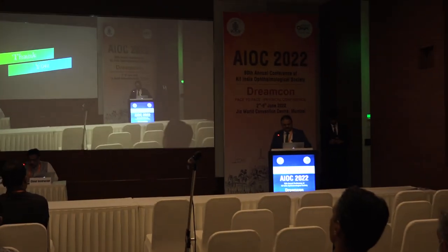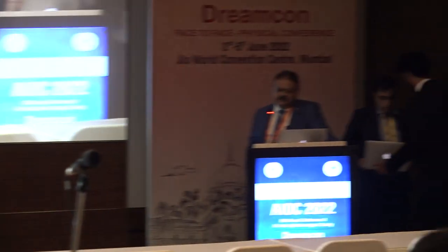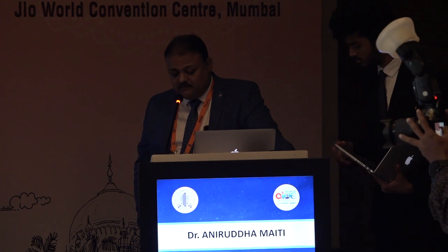Thank you, Dr. Maiti, for showcasing so many unusual cases. So now, what do you think was the reason the haptic caused the iridodialysis in that case? Usually it doesn't. It's a very rare instance, but I think while removing the IOL, I should have been more careful, and the light pipe can be used as a guide so that it doesn't touch the iris.